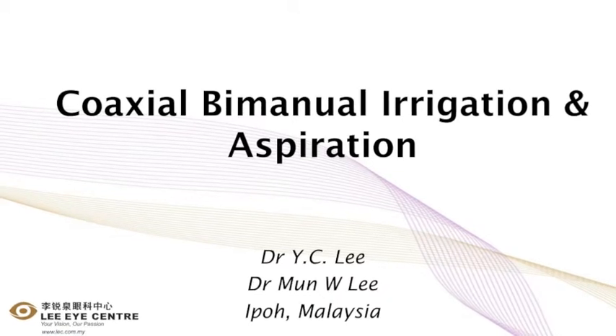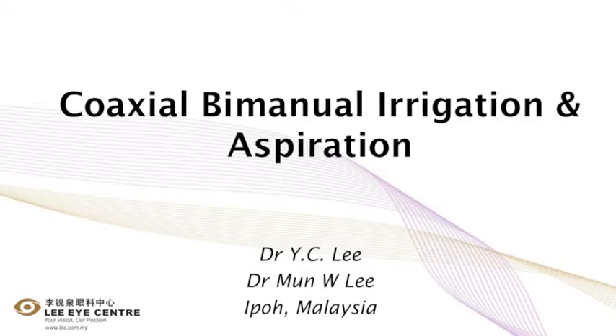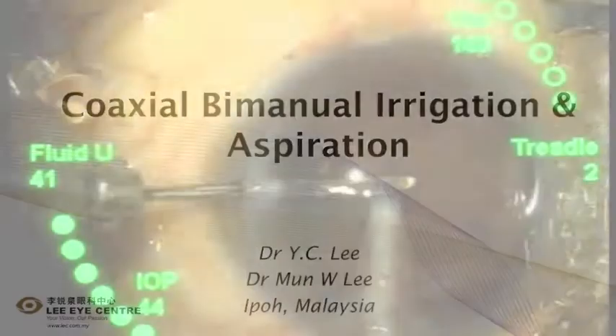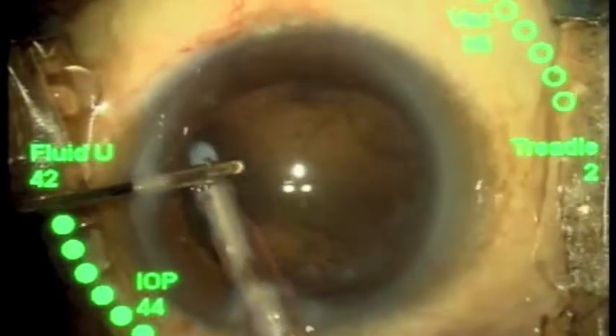This is Dr. Mun Lee from Ipoh, Malaysia. This video highlights a technique of bimanual irrigation and aspiration by using the standard coaxial I&A handpiece as shown here.